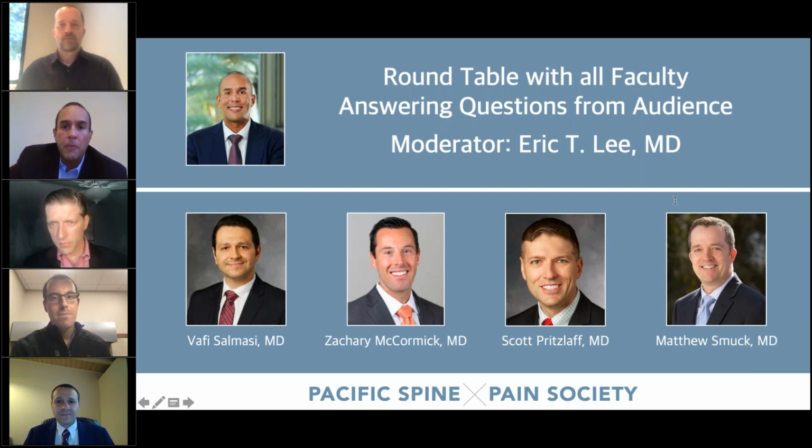I have not encountered that. Yeah, not in the sacroiliac region, not so much. So I think if you're going to have a neuritis, the most common place would be after cervical RFA.